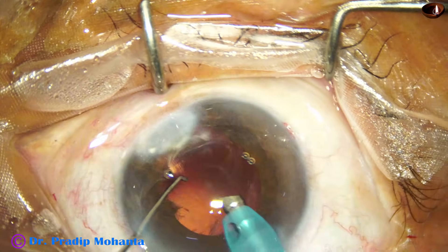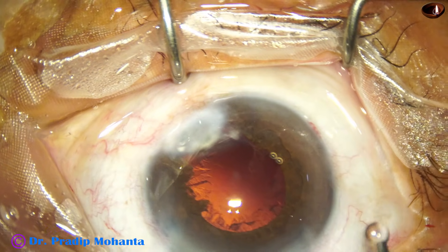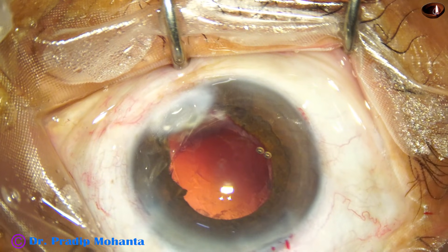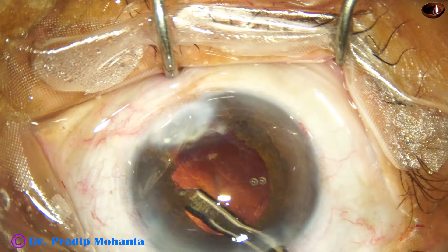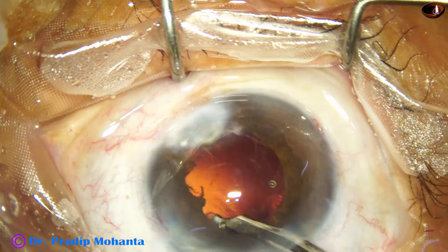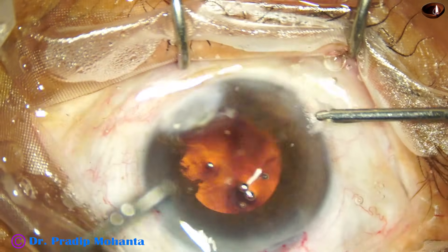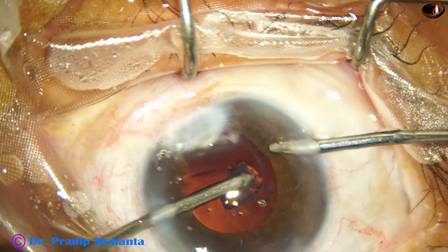The nuclear shell is removed. Some cortical matter is remaining. Inject some viscoelastic. And now I take a 23-gauge Simcoe cannula and remove the cortex from the lower part. Even the cortex from the left side, from 1 o'clock to 5 o'clock, has been removed. And now I use bimanual irrigation aspiration to remove the rest of the cortex.